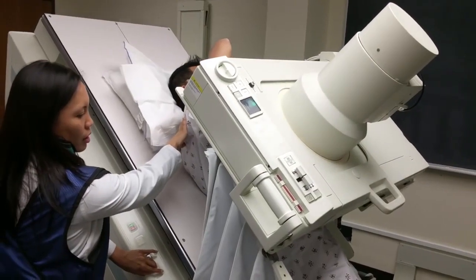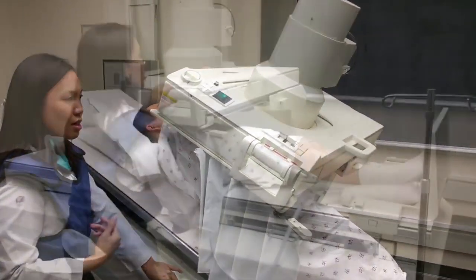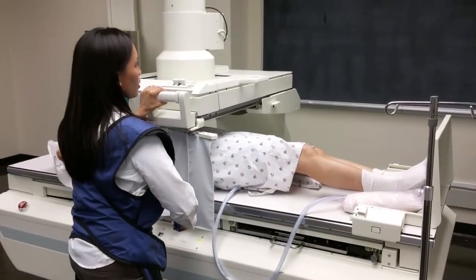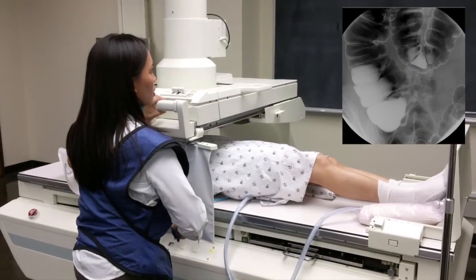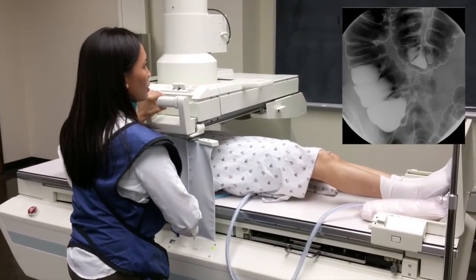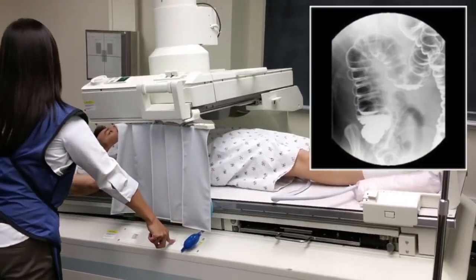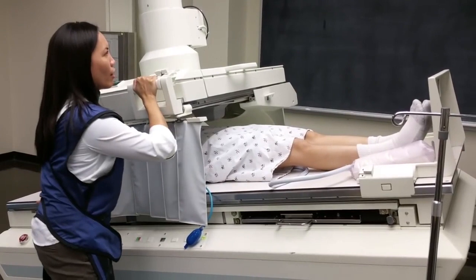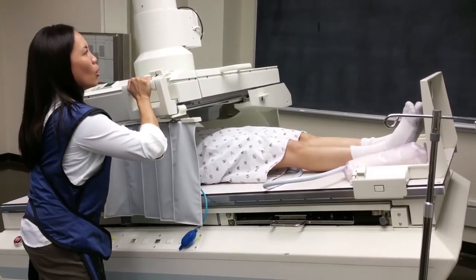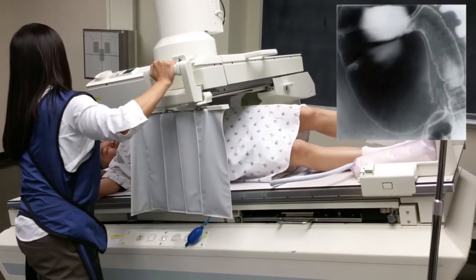You may get a good image of the proximal ascending colon or the inferior portion of the transverse colon. At this point, if contrast has refluxed into the appendix and terminal ileum, take an image. If there's too much contrast in the cecum, you can tilt the table slightly Trendelenburg and roll the patient to their right so the barium moves to the ascending colon and air fills the cecum.